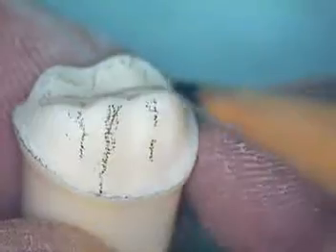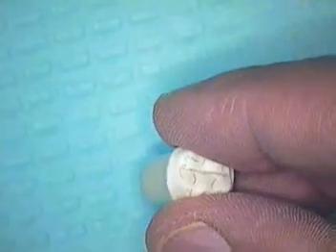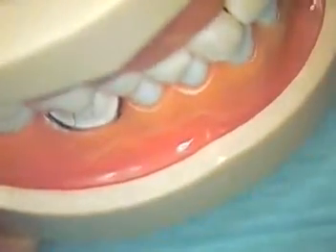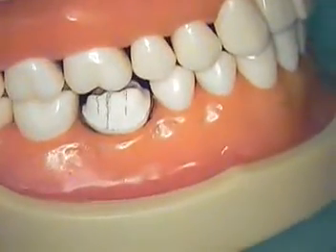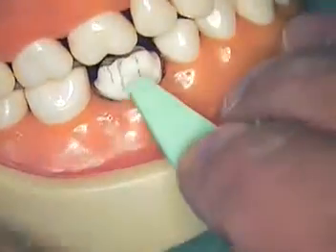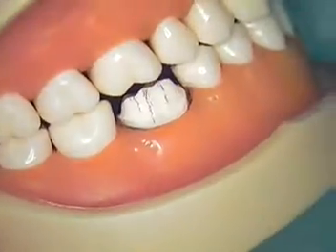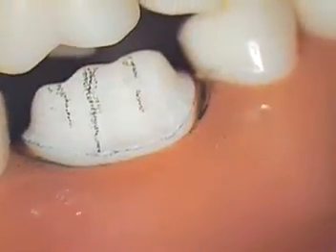We're allowing even thickness for the final restoration. Let's take a look now on the typodont how this tooth looks and check the occlusal clearance using a clearance tab — the green one you'll have in your kit. Place your tooth in your typodont and close it all the way down. Here's my occlusal reduction — this should pull out very freely. This is exactly 1.5 millimeters thickness, so we've got lots of room to make our crown, and our margin is at or just above the gum line.